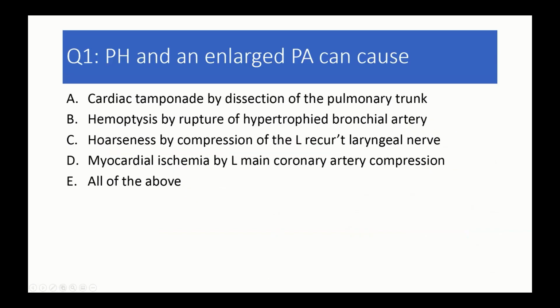So let me put up a question here and see if people in the chat can give me one of the A, B, C, D, E letters as your best guess. And the question says pulmonary hypertension and an enlarged pulmonary artery can cause which of these?